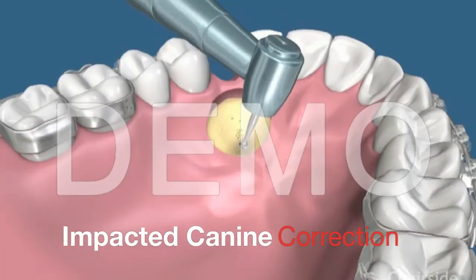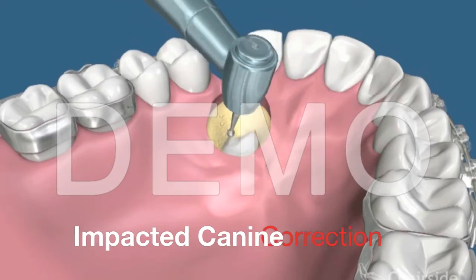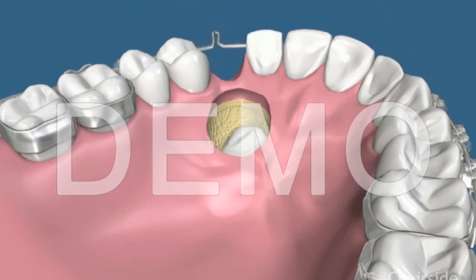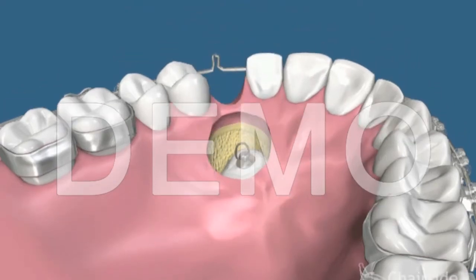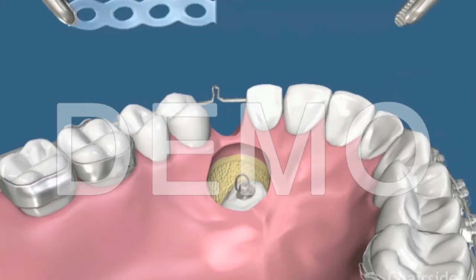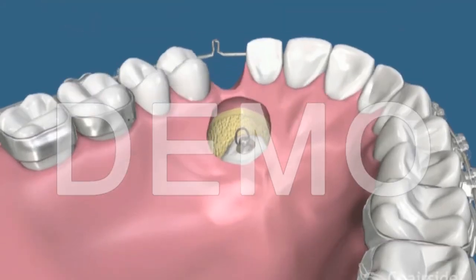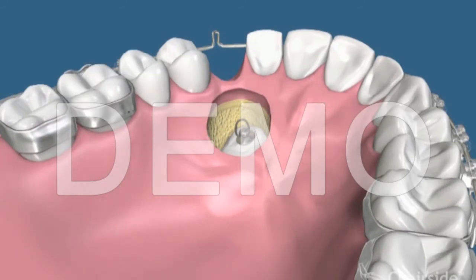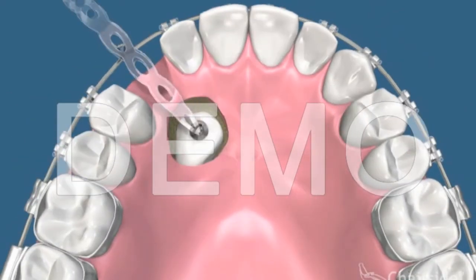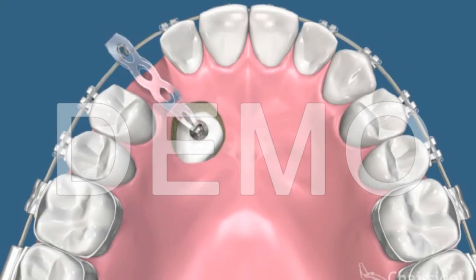The bone is then carefully removed until the impacted tooth is exposed. We then attach an orthodontic button and a loop to the impacted tooth. An elastic or gold chain can be used to create the force needed to move the tooth into place. The tissues around the impacted tooth heal and distort as the impacted tooth moves towards its final position.